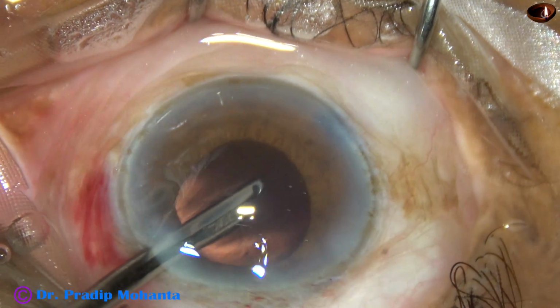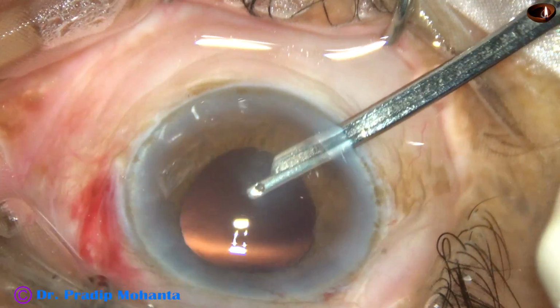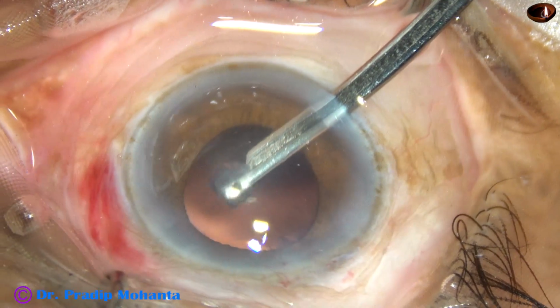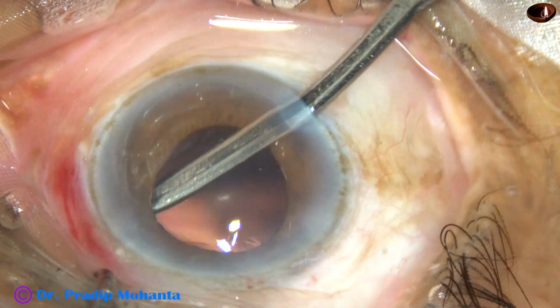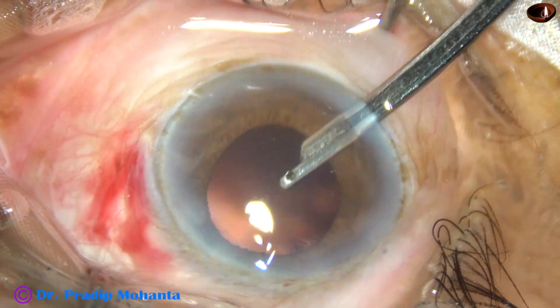And this is the cortex at 11 o'clock and I'm checking if there is any cortex. Yes, there was some cortex at 1 o'clock. Yes, some at 12 o'clock. And some cortex at 2 o'clock also, that has been removed.